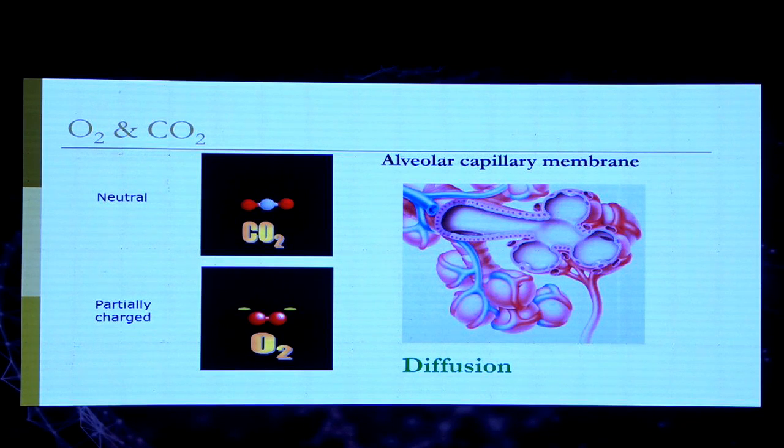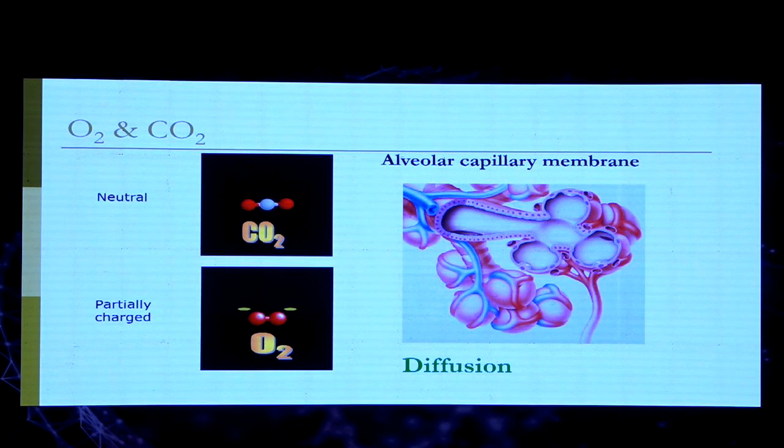And therefore, the rate limiting step for carbon dioxide is not diffusion. It is actually removal of the molecule from the air sacs, which depends on how much air volume, which is tidal volume, and how many times you can do it in a minute, that's the rate. So what determines carbon dioxide removal is tidal volume and rate. And what determines tidal volume is the pressure gradient. In conventional ventilation, it's the difference between PIP and PEEP, but for the pressure gradient in high frequency, you have a knob called power.